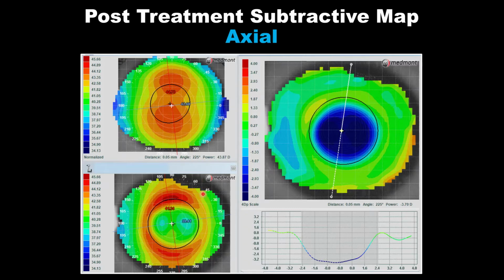So from the beginning of time in ortho-K treatment, we're going to assess that patient, comparing always the baseline to the post-treatment. So a year from now, 2 years from now, 5 years from now, we're comparing the current effect in relationship to the baseline effect. So that initial pre-fitting corneal topography is so important to you.